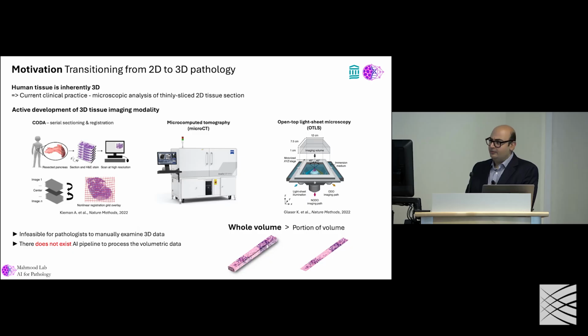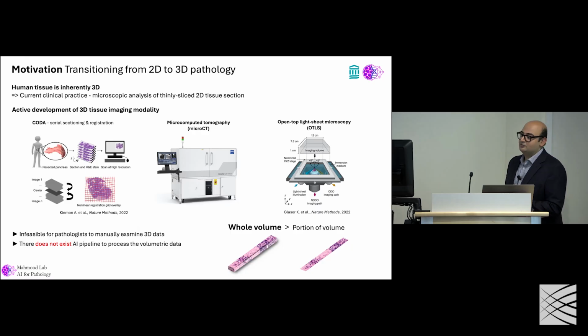But there are no good computational pipelines that I can directly use on three-dimensional data, and this data is very large and complex. Whole slide images can already be 100,000 by 100,000 pixels, and when you add another dimension to it, it becomes very, very complex.